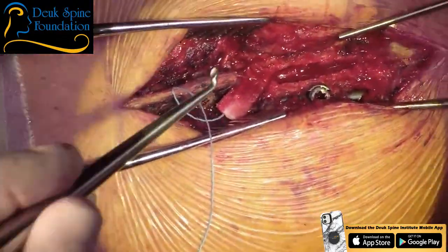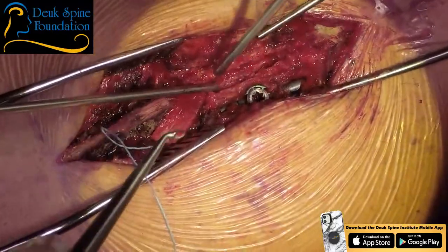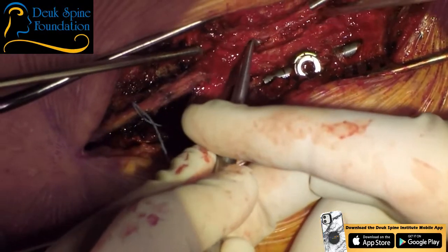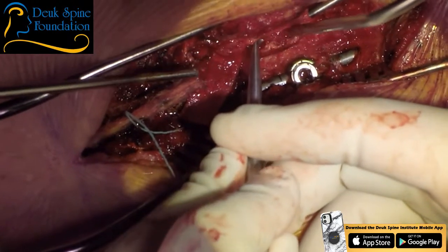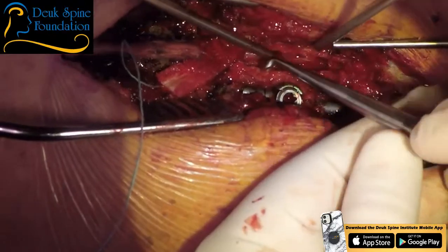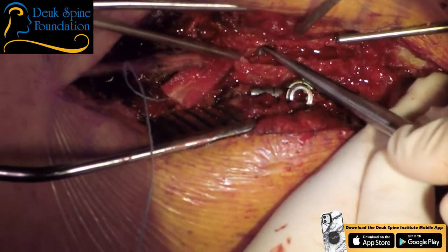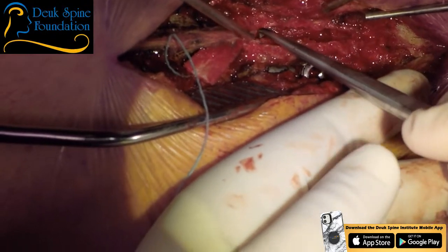All right, let's go. What I'm looking for is right here. See how it's stuck down right there? And it's kind of pushing in. I need to get separation between the cord and that piece of bone so I can bite it out. If you don't get the separation you need first, you'll bite the dura and the spinal cord will come out with it. And that's really, really, really bad.